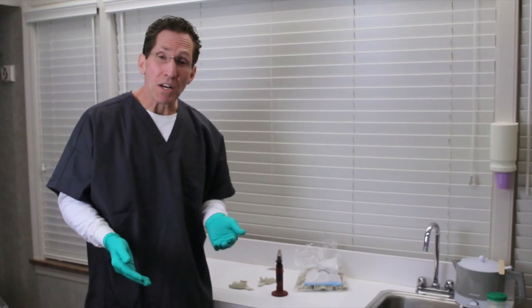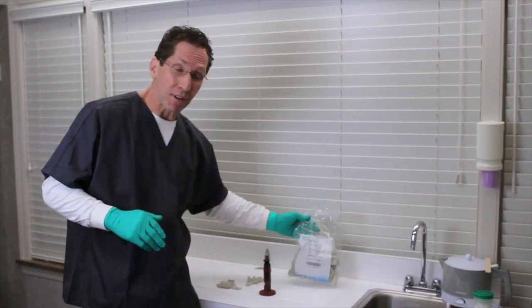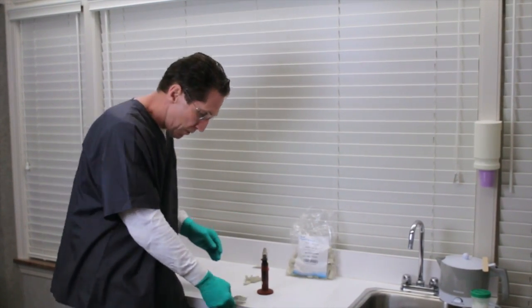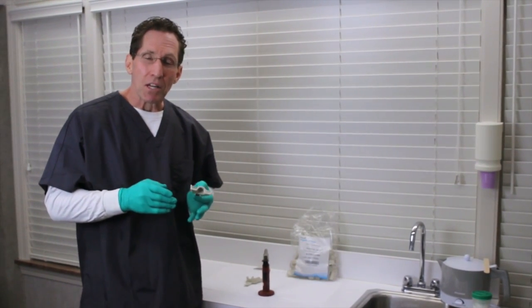Okay, in our procedure section, the very first thing we want to start with is our tray selection. And we already described briefly that, again, we use the water pick impression tray, the disposable trays, largely because, number one, they're rigid. It's a rigid material, but also something I'd like to demonstrate to you here is the fact that they're easily modified. And that's really an important quality.